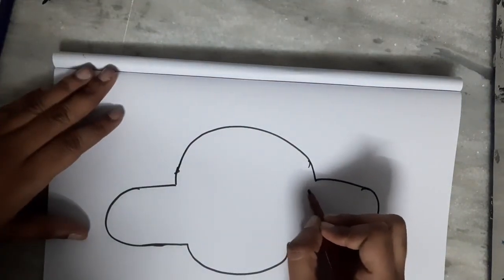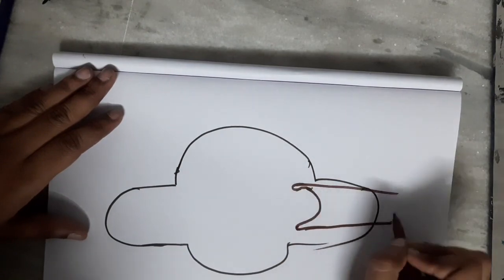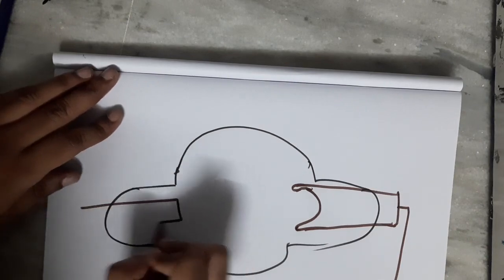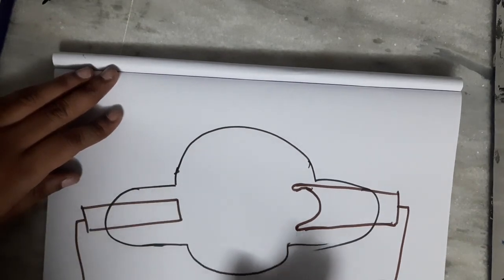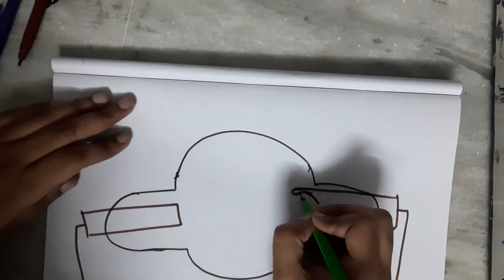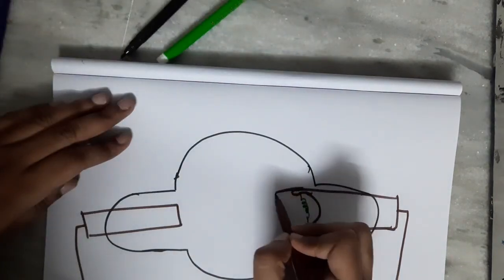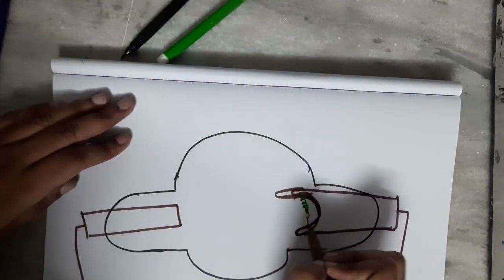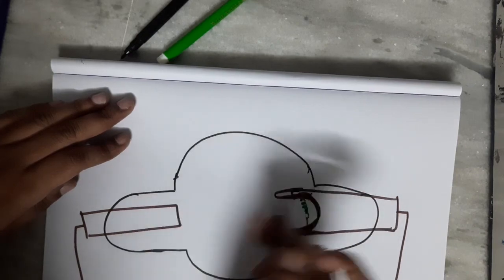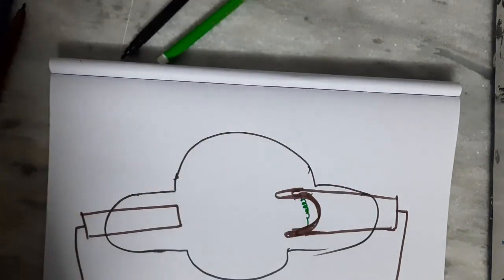So this is the focusing cup. From now I'm drawing the X-ray tube with the focusing cup, because we have introduced the concept of focusing cup. Now in the focusing cup we have the actual filament. So this hole is the focusing cup. It will allow the X-rays only to move in one direction, and it will not allow the X-rays to go in other directions. This focusing cup is made up of nickel.